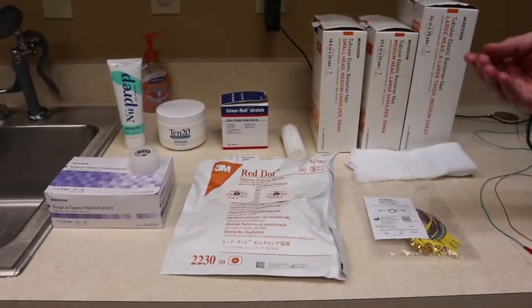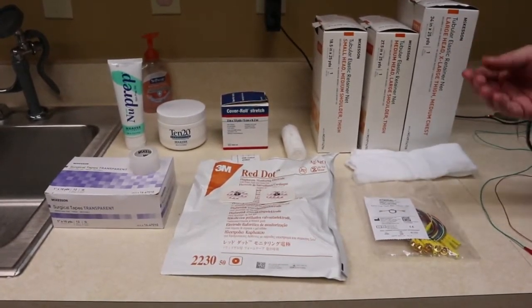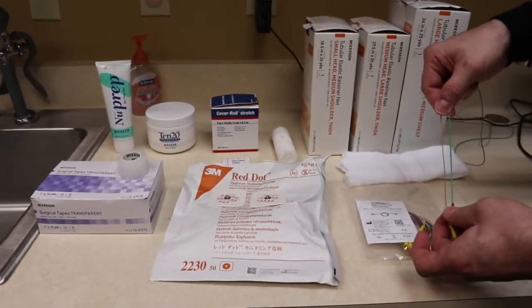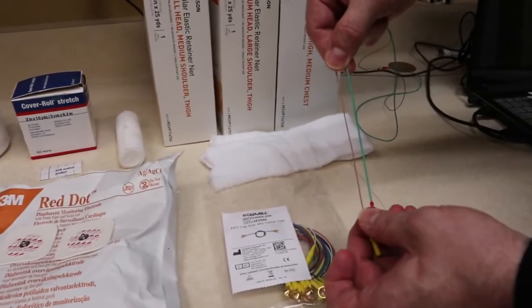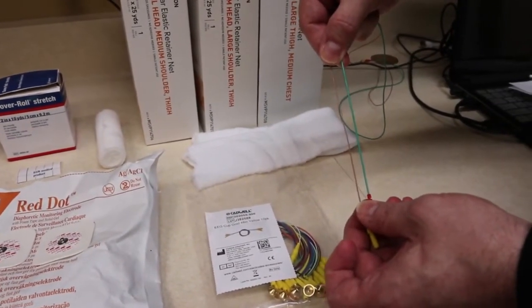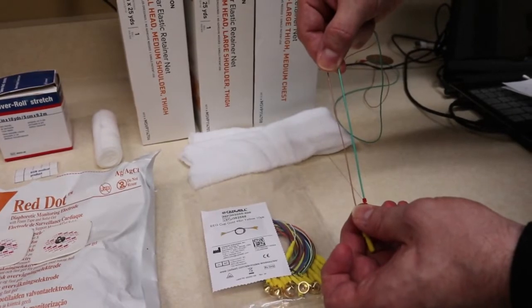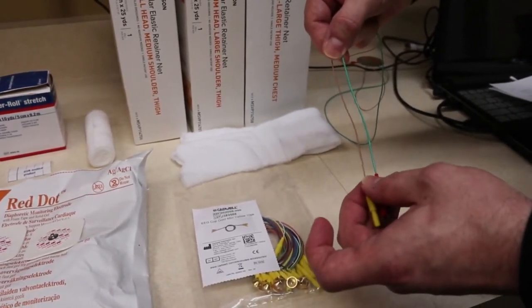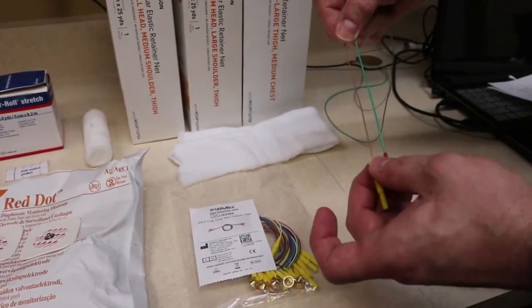That thinness alleviates a lot of the tension coming from the electrode itself. The brown one that I use is about twice as thin as your standard electrode, which means you're going to get a lot less tension coming from the wire itself and a lot less pull off the electrode.